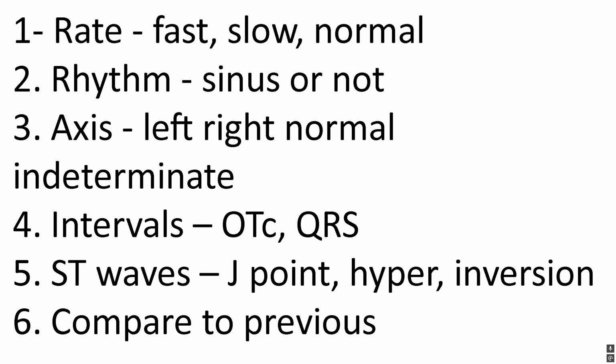A couple things. Number one, remember we don't treat an EKG, we treat a patient. And the value of any EKG depends on your pretest probability. Those are the main things I want you to take away from this. Second, when I first started, I had no idea what I was doing.